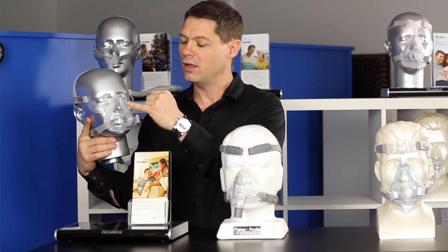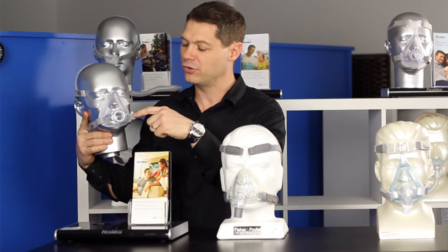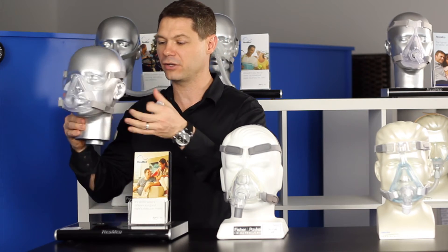Rather than a strong stream of air hitting the person that you're lying next to, they have a diffuser. So the exit air is diffused everywhere in a circle, which makes it much softer as far as that goes.